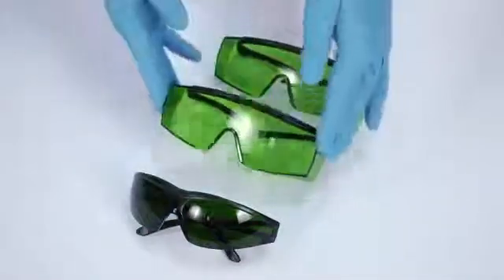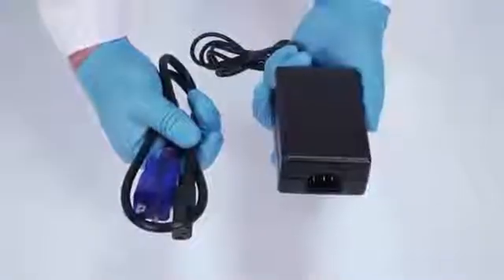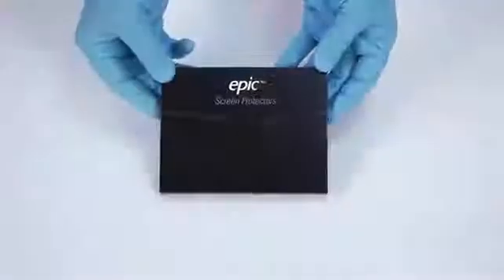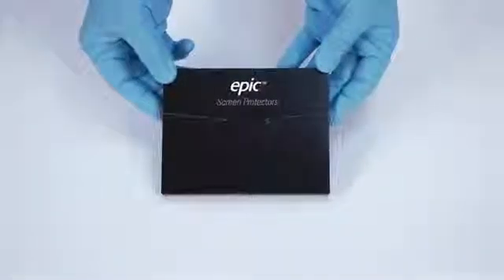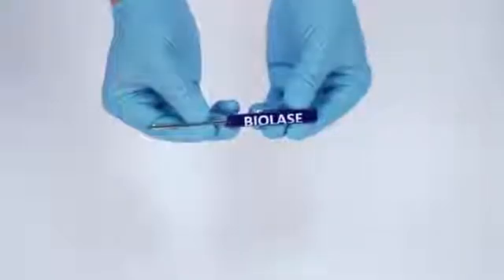The bottom layer contains three pairs of protective laser eyewear — a pair for the dentist, a pair for an assistant, and a darker pair for the patient — as well as the power supply and cord for EU and North American countries, screen protectors for the EPIC touch screen, a remote interlock cable, and a Phillips head screwdriver for replacing foot switch batteries.